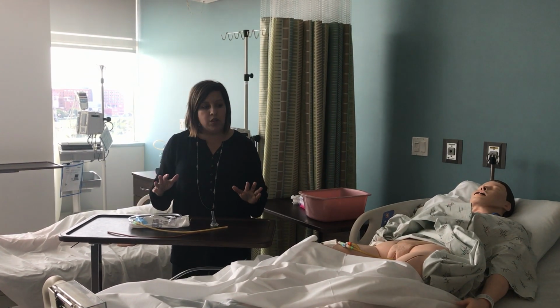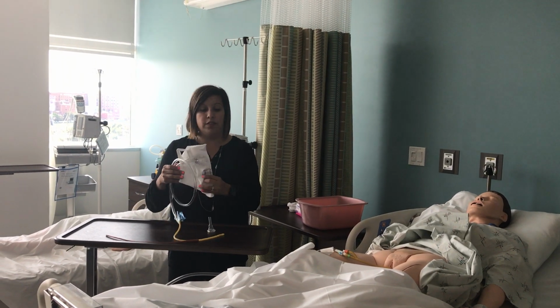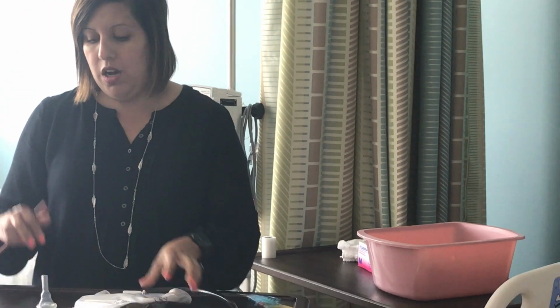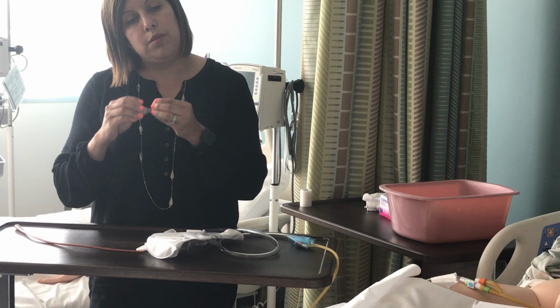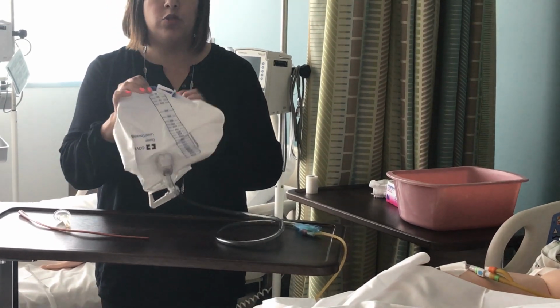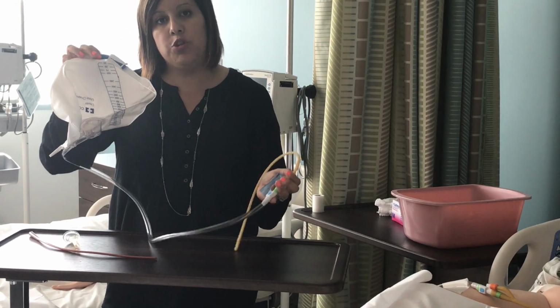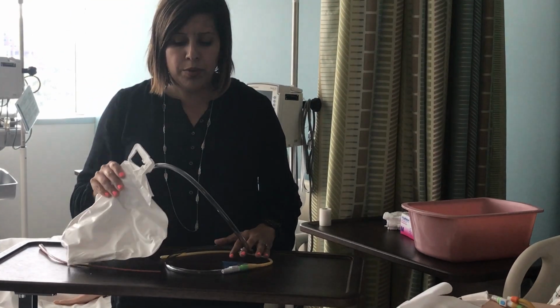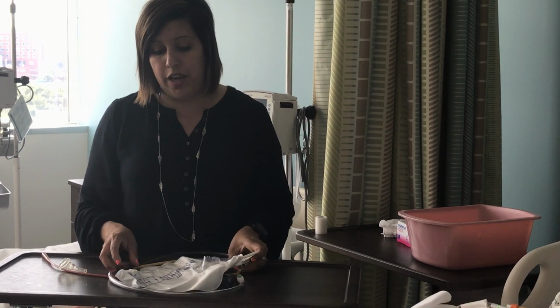One of the things I want to start with before we get started is understanding what type of devices can be used for catheterization. We have three different tools: a straight cath, a condom catheter, and an indwelling catheter. These catheters are placed in the urethra and inserted into the bladder so that it can empty out the urine. The one I'm going to focus on is this indwelling catheter, which we call a Foley catheter.